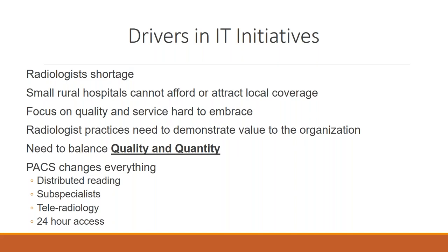For those of you that have been in the industry long enough to know, the file room used to be the gathering point of all the surgeons and the referring doctors in the morning. They'd come through, stop in to see the doctors, review their images, and they had this very personal connection with the doctors. What PACS did was push the images up to the floors and basically push those doctors, surgeons, and referring doctors away from the department, where they're now looking at their images remotely, sometimes calling in and coming down. They still have that consultative piece, but it's certainly not what it was years ago when they came through the department every day.